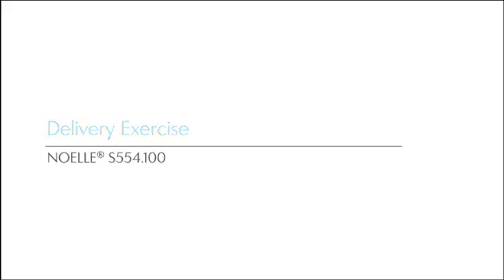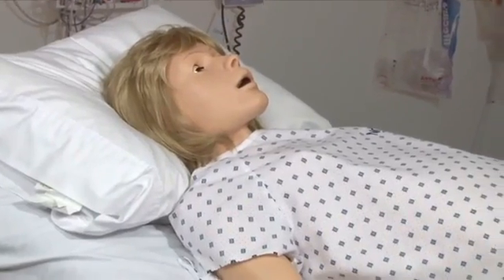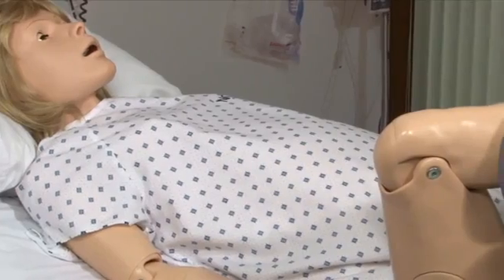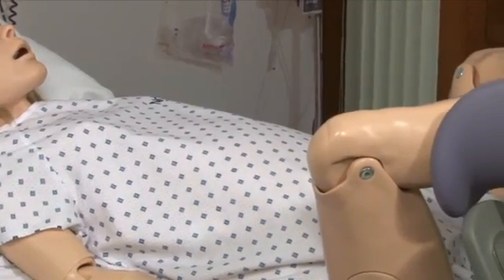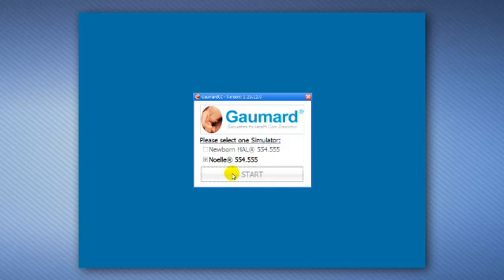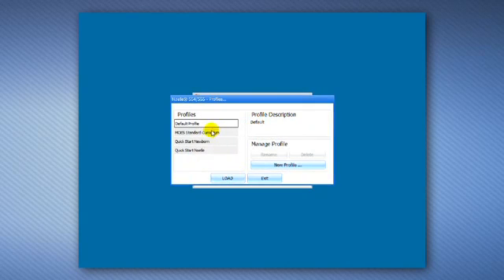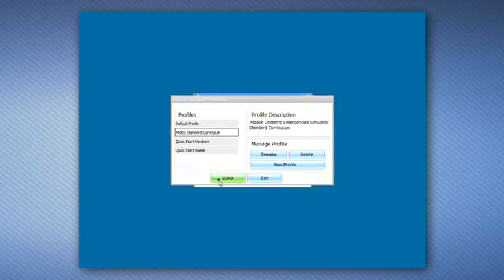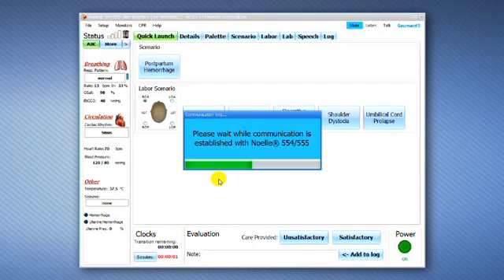Noelle Delivery Exercise. Follow along this portion of the video to prepare Noelle for an operative vaginal delivery scenario. Additional information about this scenario is found in the MOES Scenario Handbook. To begin, power on Noelle and load the MOES Standard Curriculum Profile.